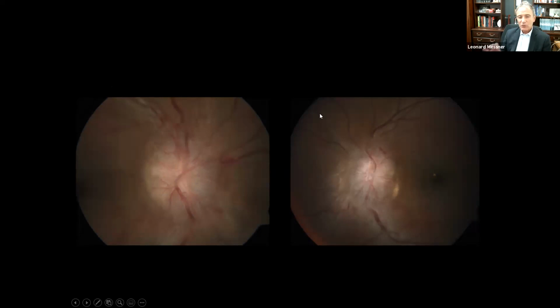And one of the real concerning features of the appearance of these optic nerves is that we see the optic nerves taking on something of a pale appearance. So that's significant. With all the diagnostic tools that we have, it's still very, very important to look at the optic nerves. And we know that a pink optic nerve is generally a healthy optic nerve, and that's good. But when the nerve begins to pale, this is indicative of more chronic disease, more permanent disruption of the optic nerve and the corresponding axons. And this is where we really begin to worry.